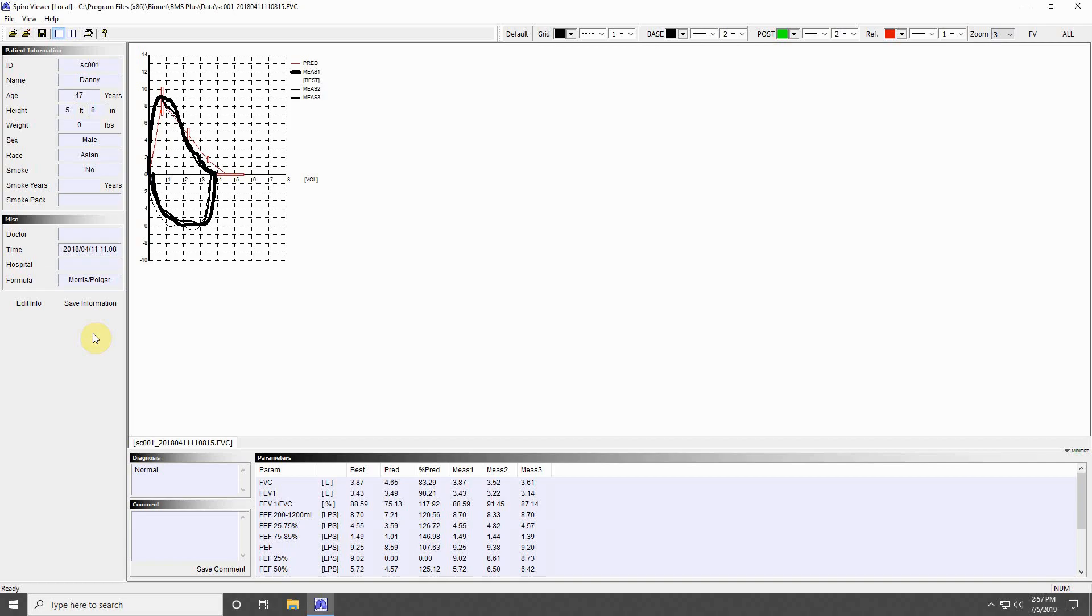At the bottom of the program is the Analysis area. This will display numerical data from the measurement and a diagnosis based on the data. You may add any comments here, and save them by pressing Save Comment.